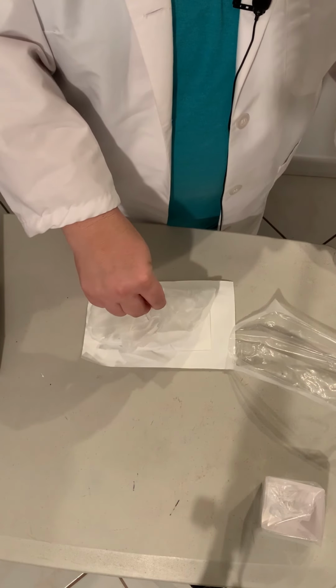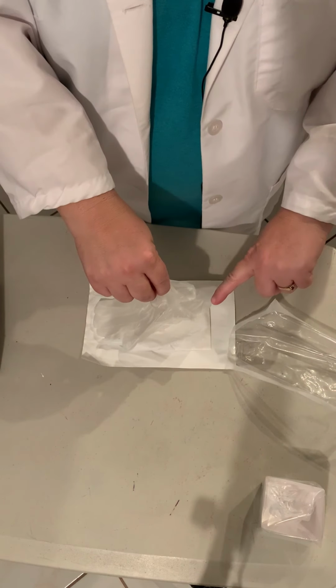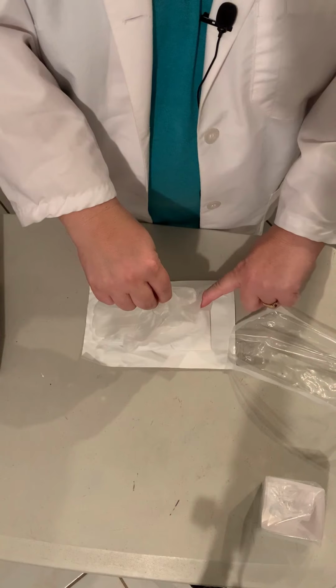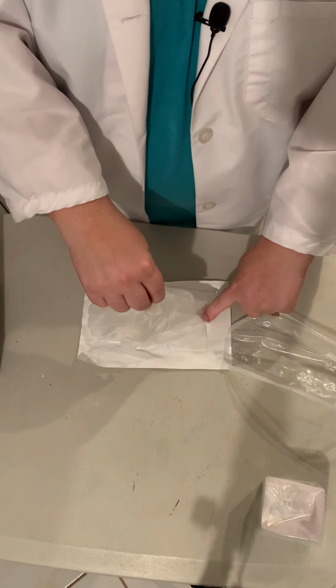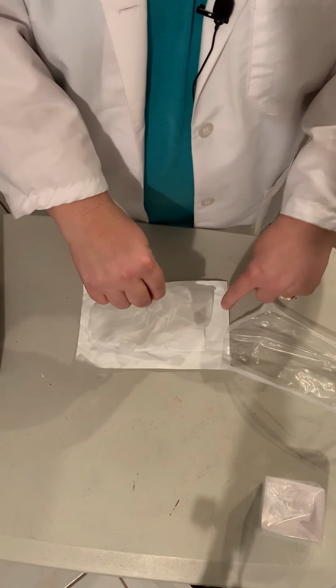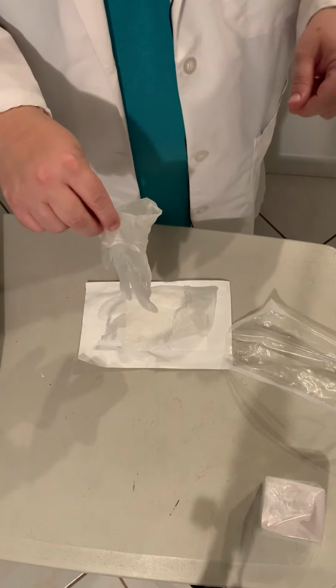These ones are coming apart so far. If I needed to, you could slide your finger inside the cuff where your hand is going to be, but not anything outside of that. Okay, so we got that.